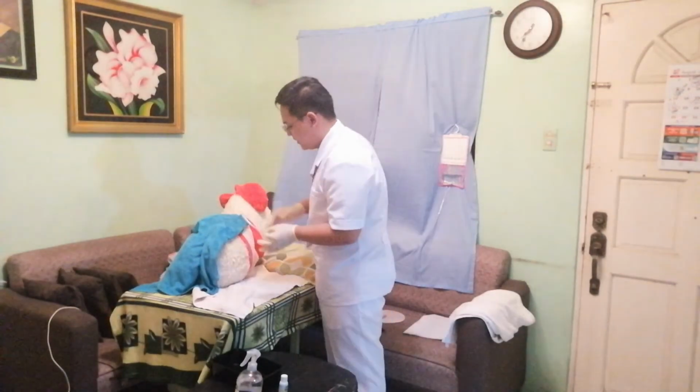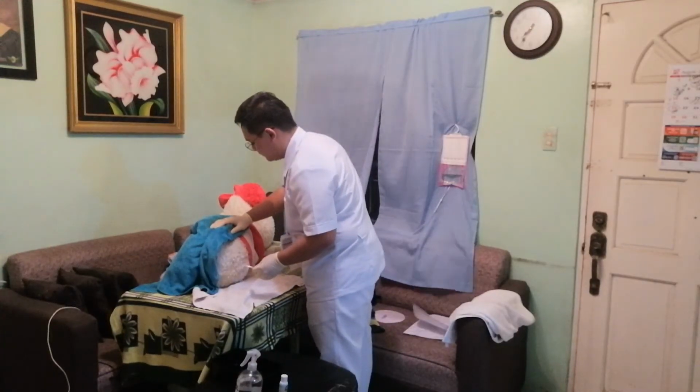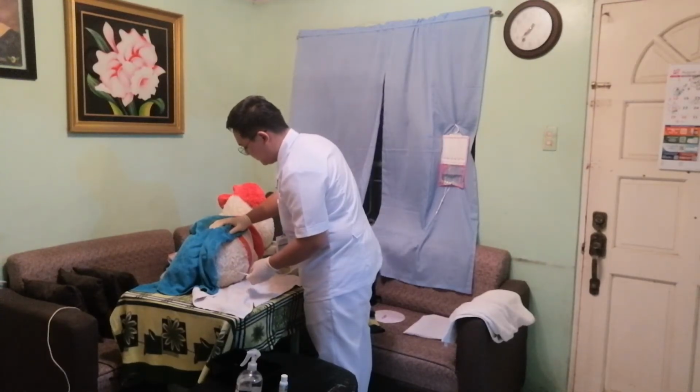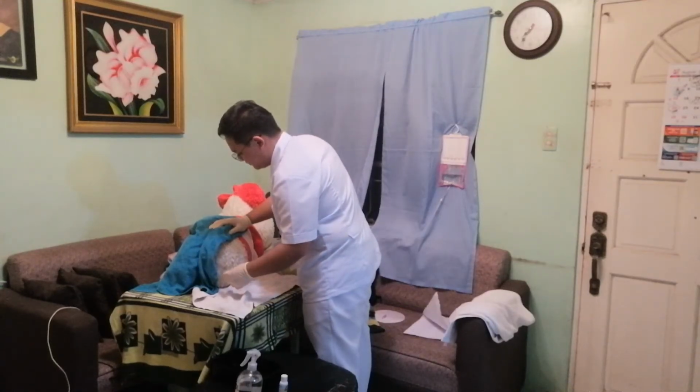Okay, so ma'am, ipapasok ko na po yung ating pong rectal or ating pong enema tube. Okay po, so ready po in 3, 2, 1. Okay.